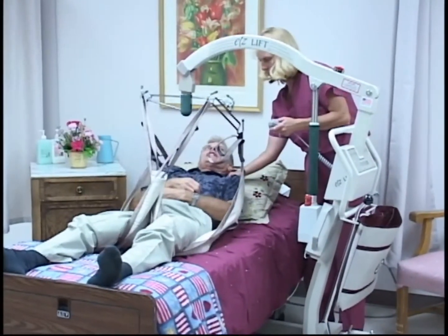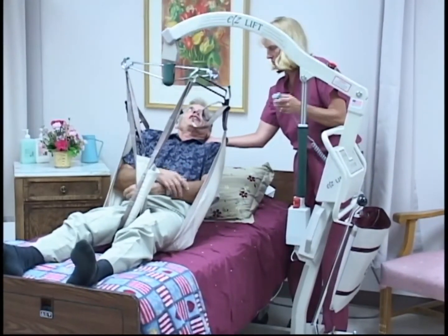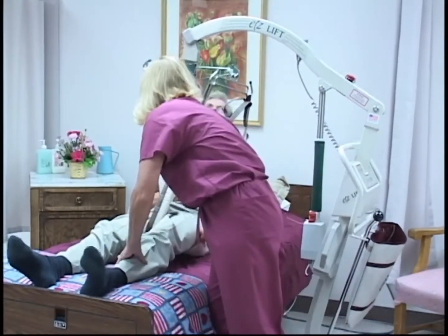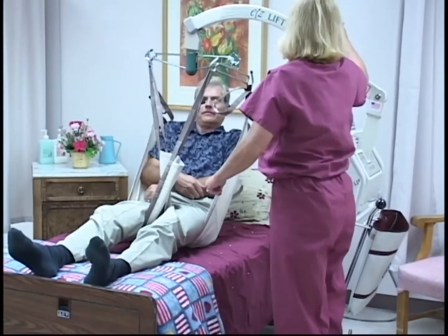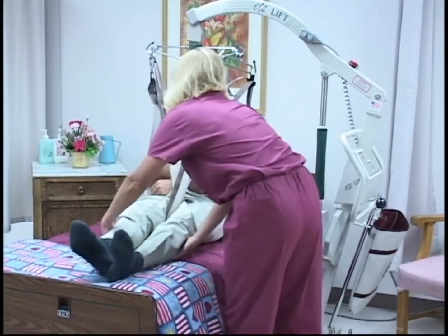Push the up button on the hand control. Once there is tension on the loop, double-check the loops to make sure they are securely in the hooks. Start lifting the patient to the desired height. If the patient is not able to support their head, assist them or use a head support sling.